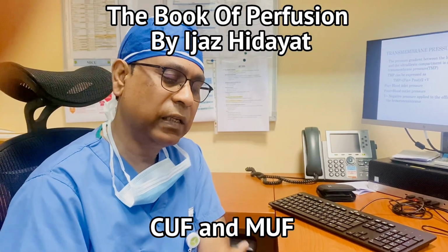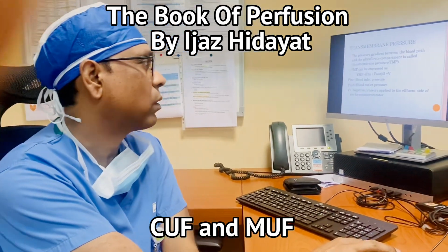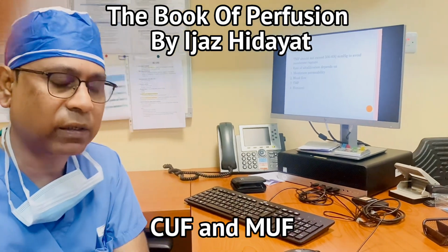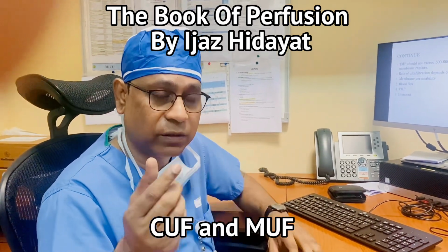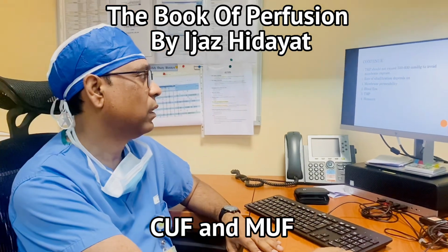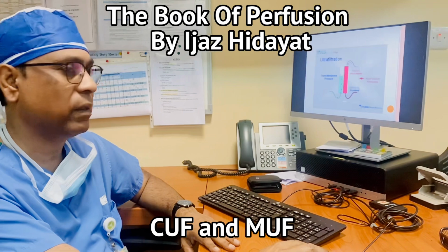The TMP, the pressure difference, the transmembrane pressure, should not go more than 500 to 600 millimeters of mercury, because if your TMP is higher than 600 millimeters of mercury, there is a chance of rupturing of the membrane. So of course the hemoconcentrator, TMP, and of course hematocrit.